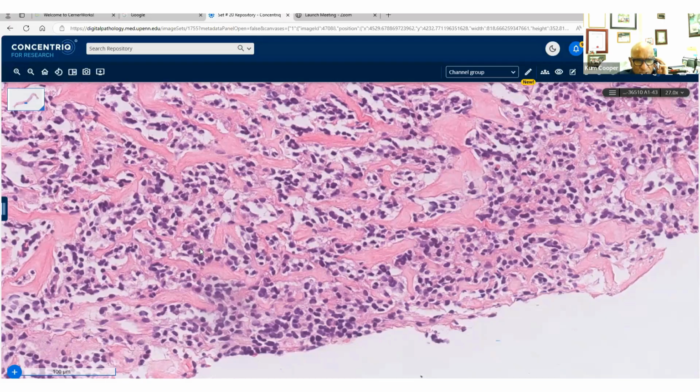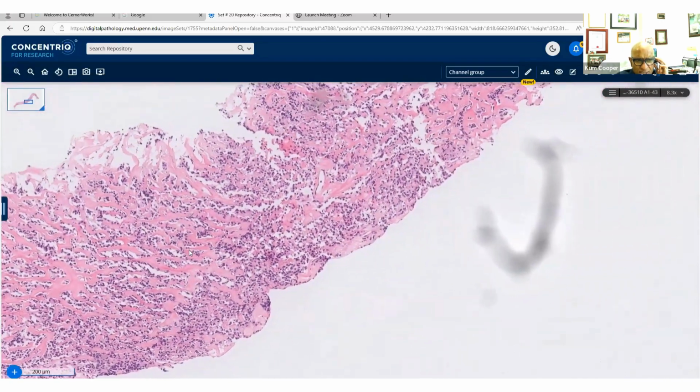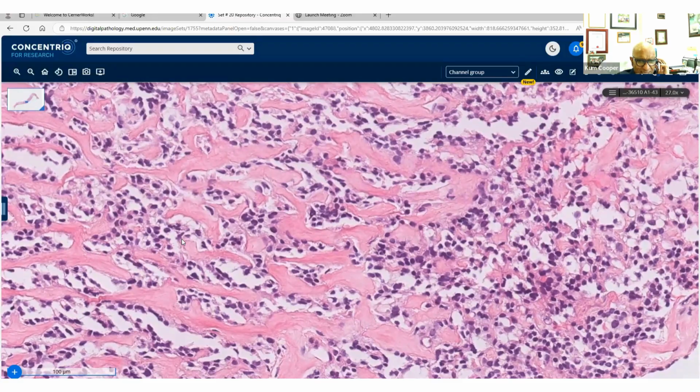On a needle core, try to give some idea of where the risk stratification would be. The resection came out as a PEComa, but even though there were no mitotic figures and no necrosis, this did behave badly because it metastasized. The follow-up was that it did metastasize to bone a year or two later.